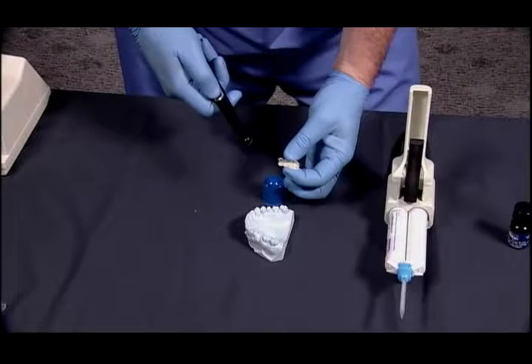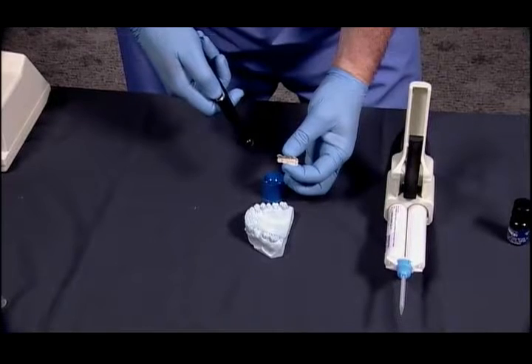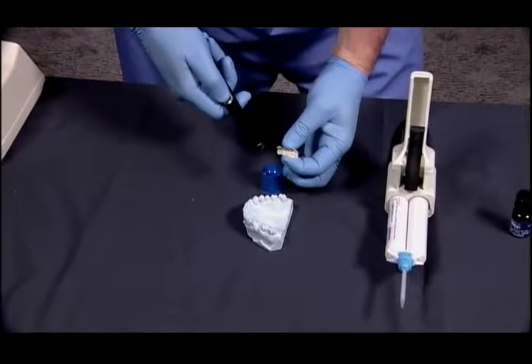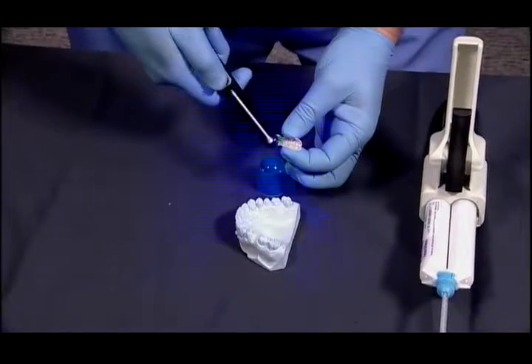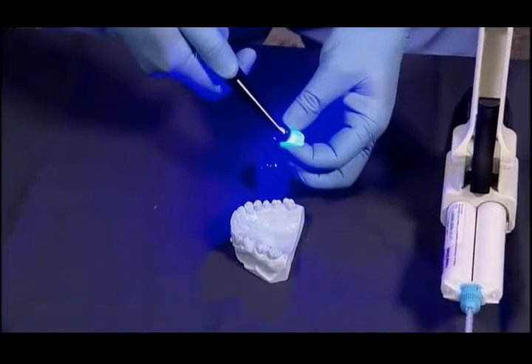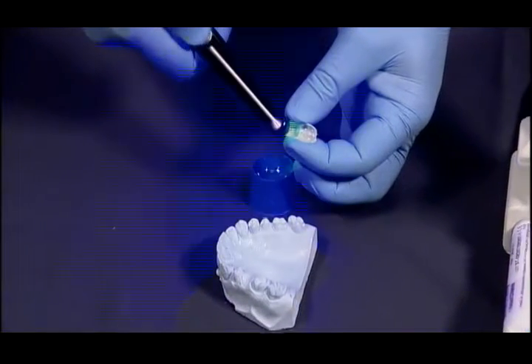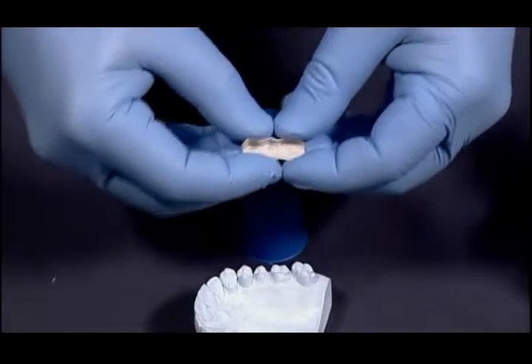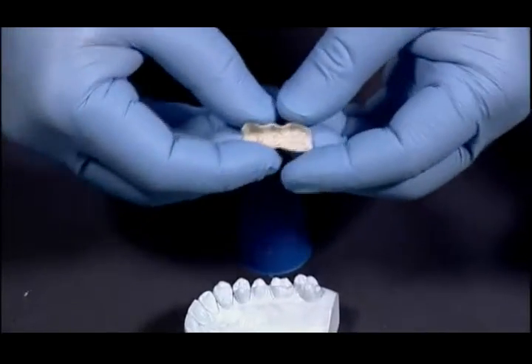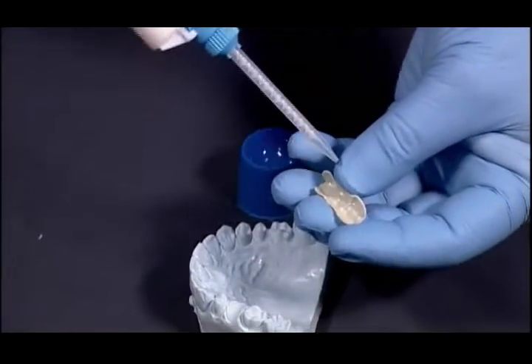The varnish that we use to put the Bis Acryl inside of the polycarbonate shell is cured by utilizing light, and you have to light cure it for 30 seconds. And for purposes of demonstration only, I've cured that for 30 seconds. And what we'll do is start to add the Bis Acryl material to the polycarbonate shell.